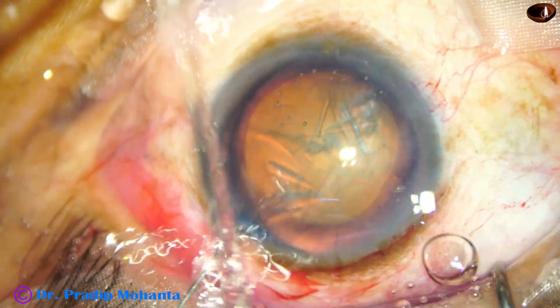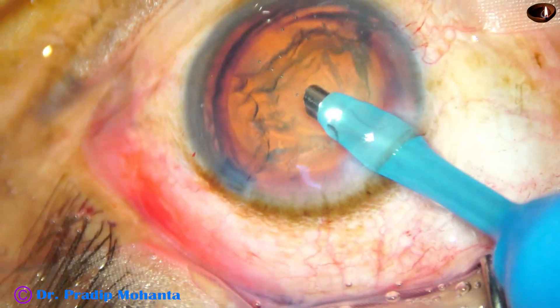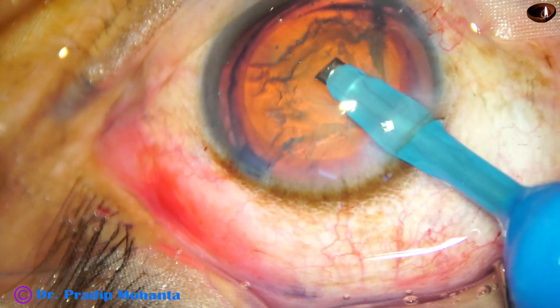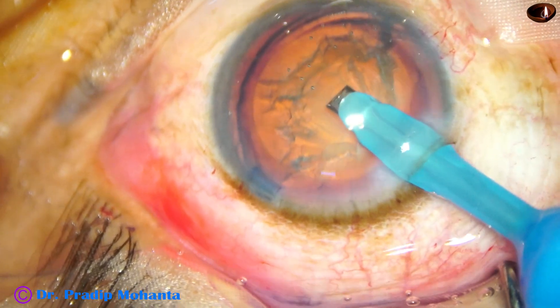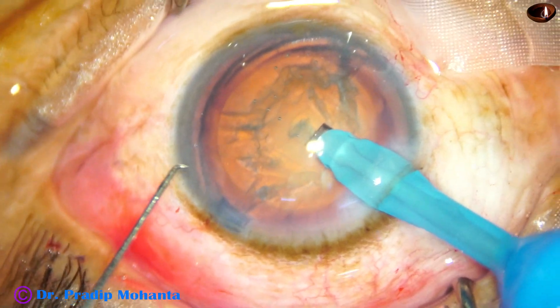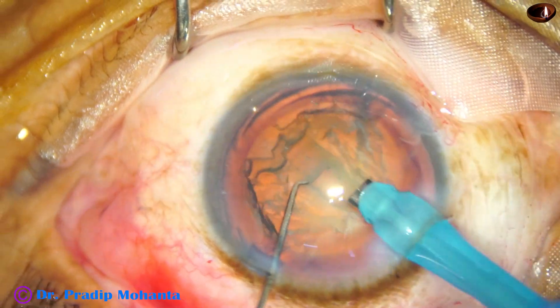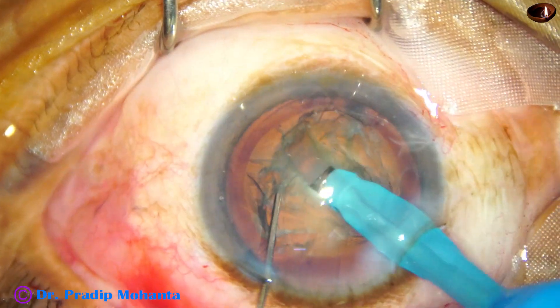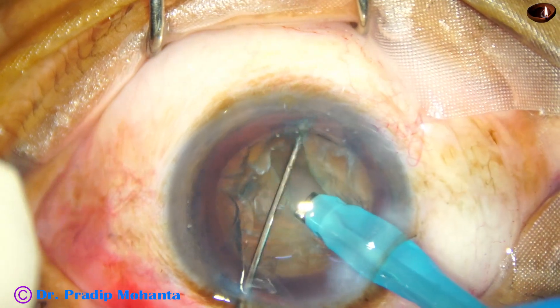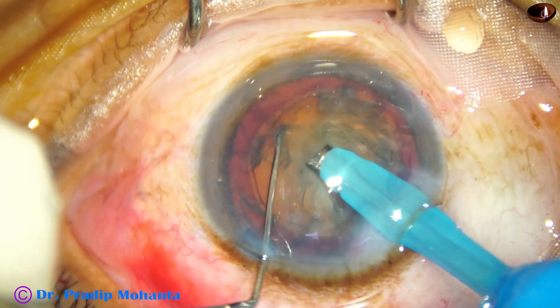Now it is time to introduce the phaco needle. The phaco needle goes in with its bevel down; some superficial cortical lens matter is removed. Now turn the handpiece, make the bevel up, and start sculpting. The power is in linear mode, so control the foot switch such that you apply adequate ultrasonic energy for sculpting. Without applying ultrasound, if you just try to go, you will push the nucleus — that is not good, as it causes a lot of stress on the zonules. You have to use ultrasound: sculpt and go.